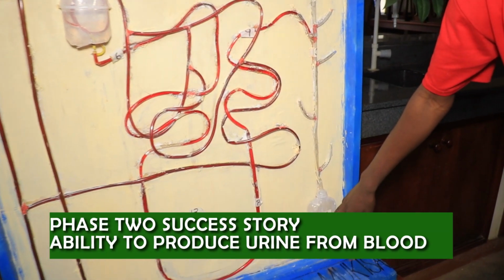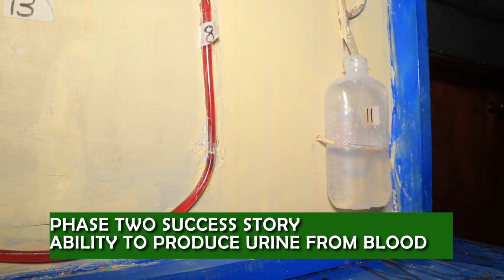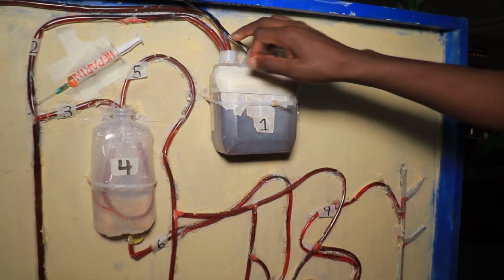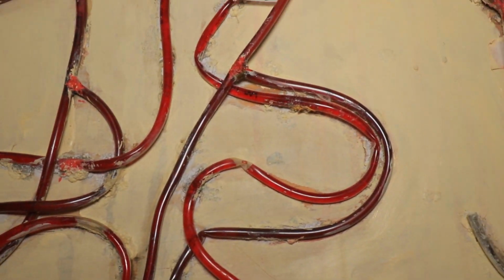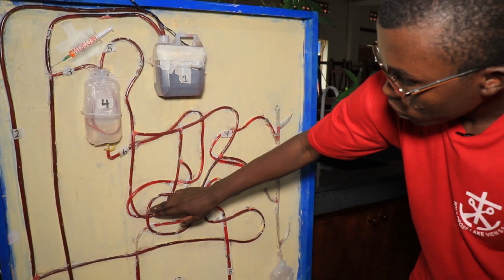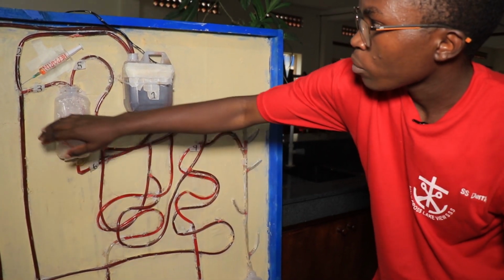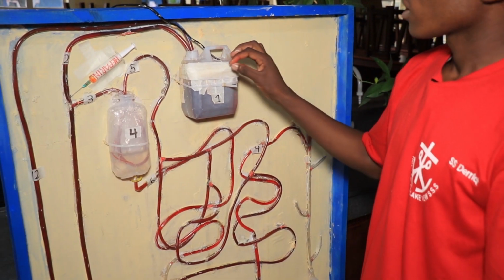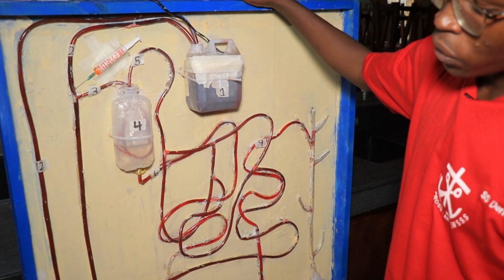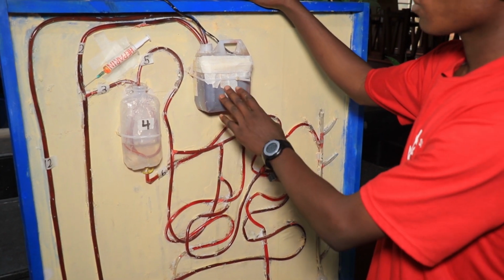You realize that at this point, the urine is colorless, and the blood that is flowing through these tubules, as you can see, comes like this and enters here. You can see the flow. So the process continues, and then blood returns at this point. This process of purification of blood, removing all toxic substances from blood, begins from the heart.